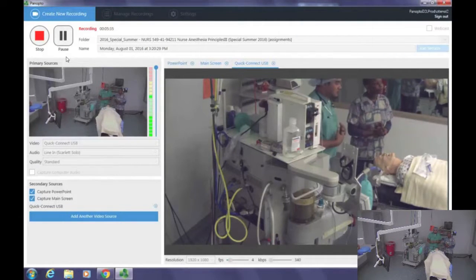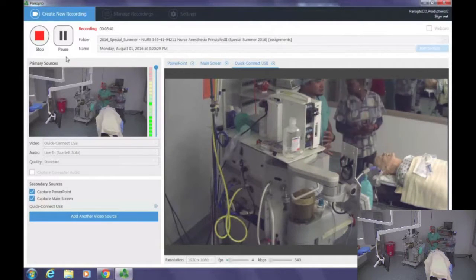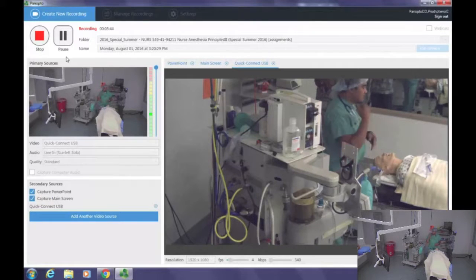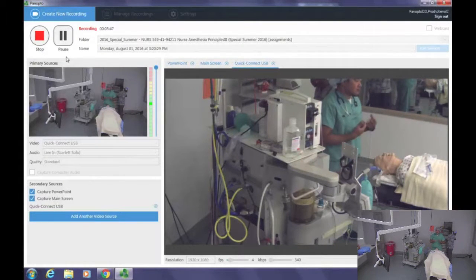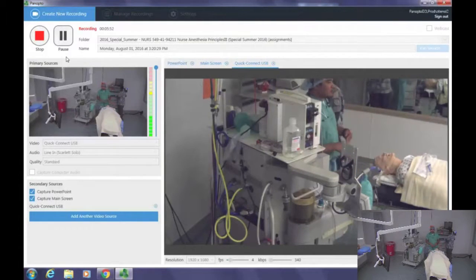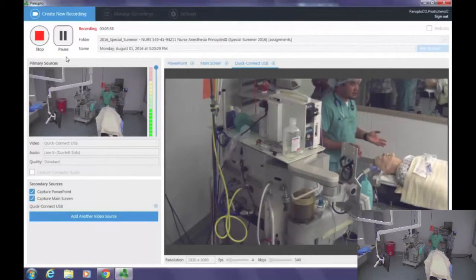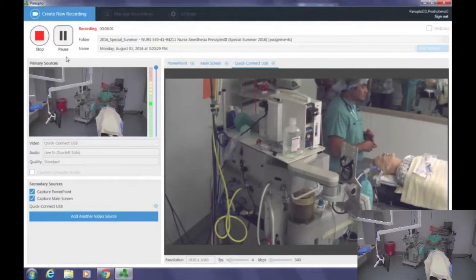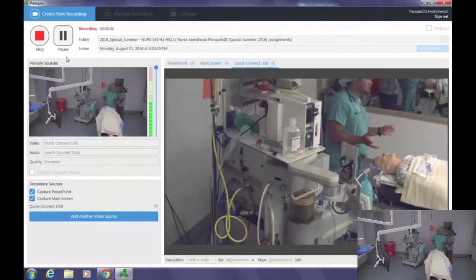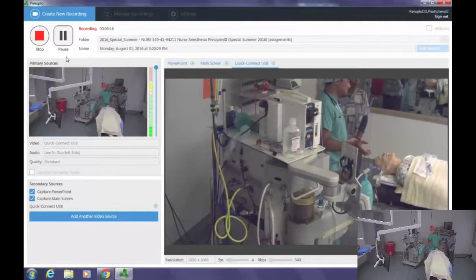Okay, so the special equipment, even before the patient comes in, there's a lot of preparation to this case. First of all, you need retractors and trocars. Also, you need an arterial line, which you could put in either intraoperatively or preoperatively. Some cases probably need TEE. For positioning, you need axillary rolls, pillows, bear huggers, fluid warmers, and most important of all is the double lumen tube, or else you won't be able to do this case.